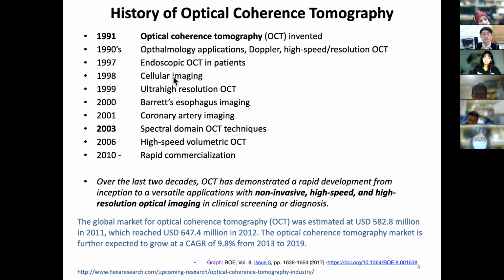And then the light source of OCT before was actually poor, like a superluminescent diode. We'll get back to this. But now, remember nonlinear microscopy uses a femtosecond ultrafast pulse laser. A pulse in time means that in frequency, it contains many wavelengths. So what that means is, in the Fourier domain, broadband can make a very narrow pulse, and this allows ultra-high resolution OCT. So this has been an absolute development and great enhancement.